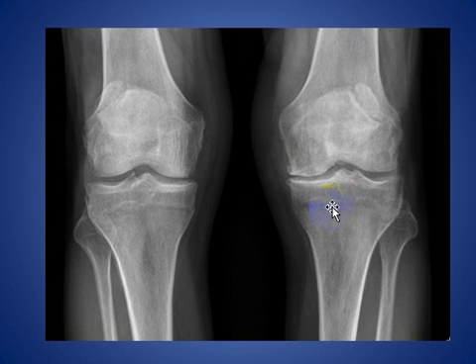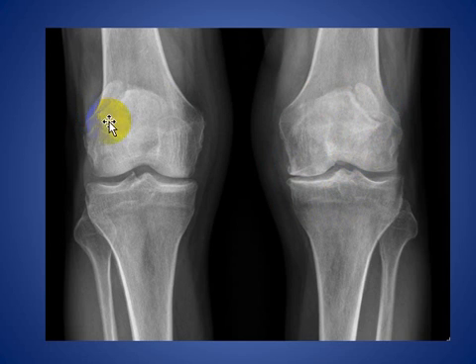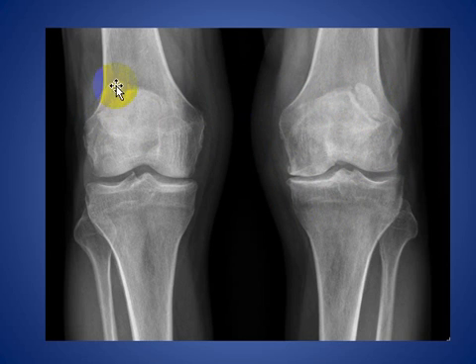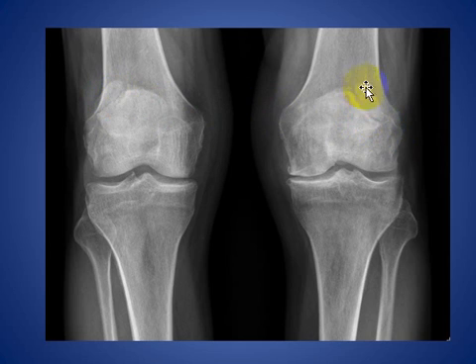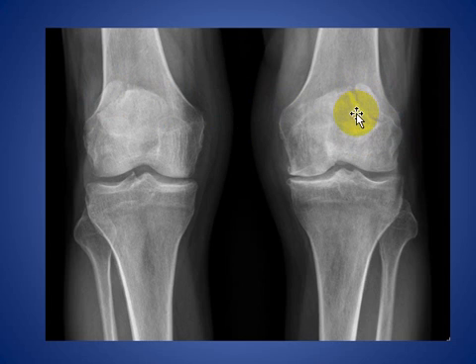What else can we see? Also, in this AP view of both knees, we can see fragments involving the superior lateral aspect of both knees — both patellae on both sides. These have rounded edges in both fragments, and this is classic, keeping with bipartite patella.